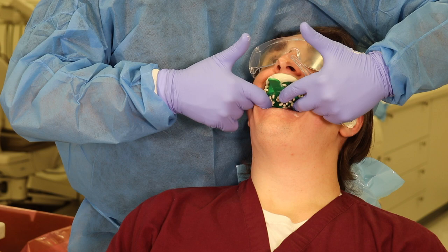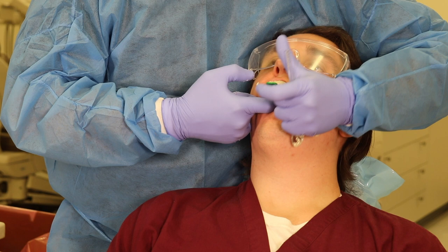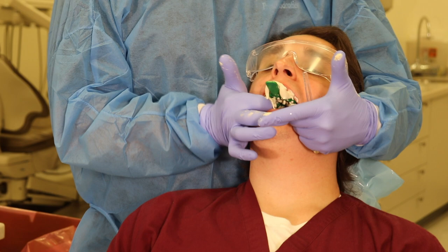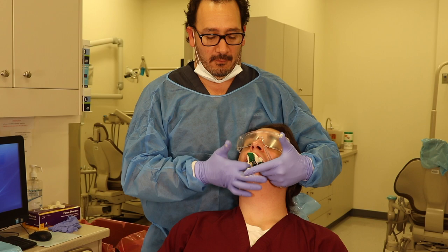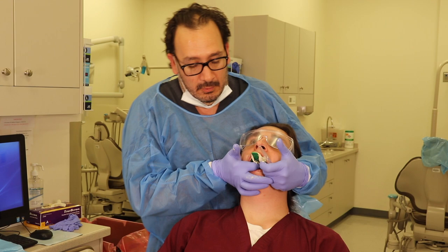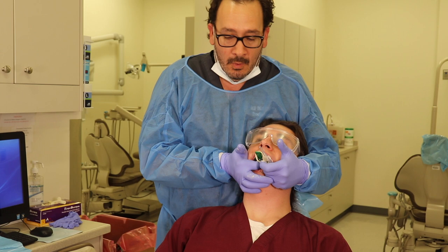As I'm doing this, I'm pulling the lips, making or overlapping the tray all the way up, okay? And here I wait. I got good support of the tray, and I also got good support of my patient. If my patient at this point starts gagging, I got good control for him to either push the face up like this or distract him.